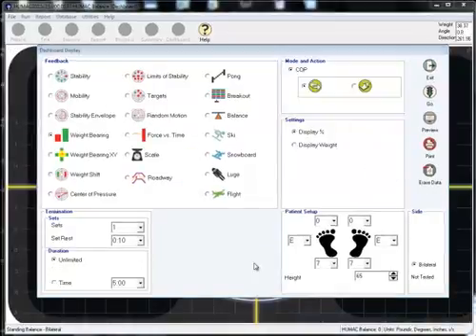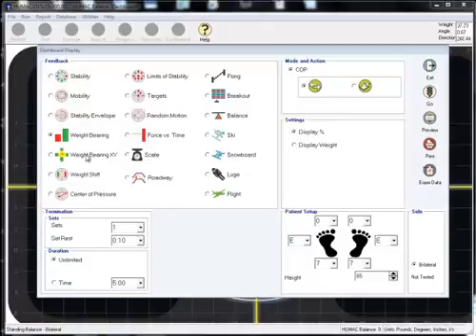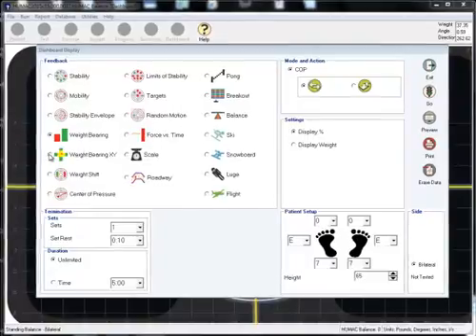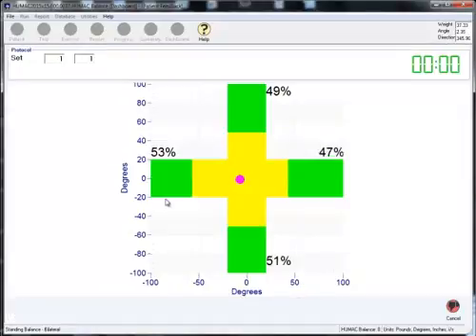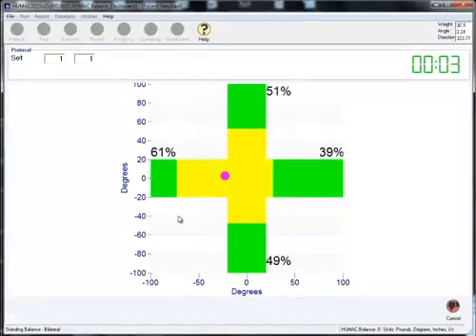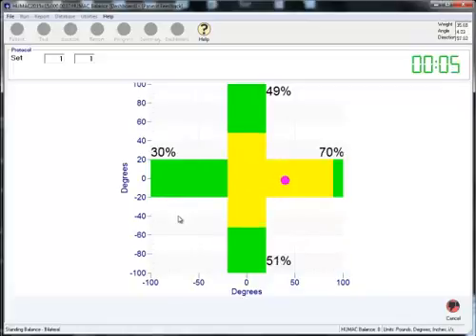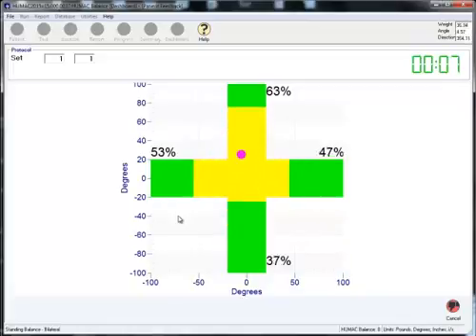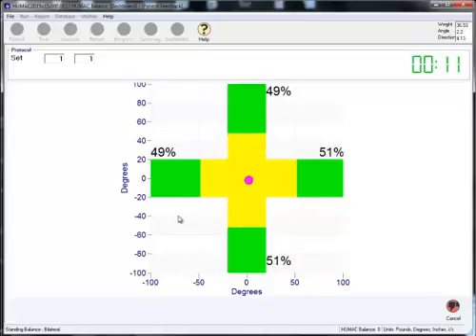If you want to display how the patient is distributing their weight right and left and fore-aft, you want to select Weight Bearing XY. Select Go. From this display, we see how the patient can shift their weight to the left and to the right, but also if they lean forward and they lean back.